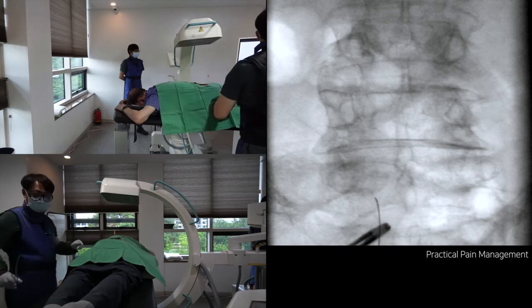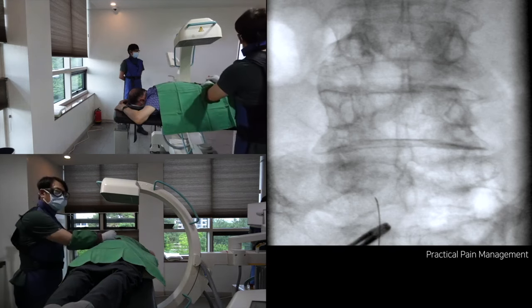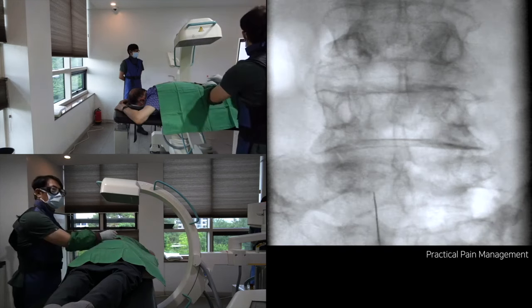But first, I will draw an imaginary line of the inferior border of the facet joint of left L4-5 and make a target point below the joint line.